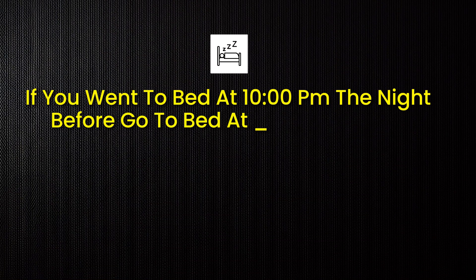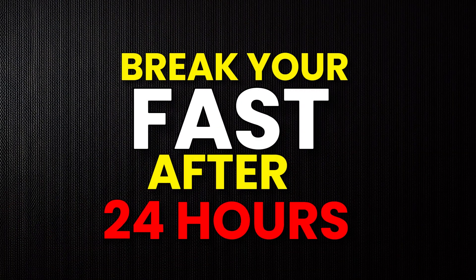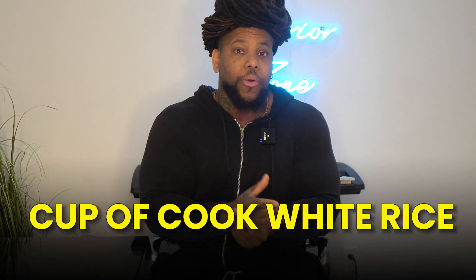I recommend doing two back-to-back 24-hour tests to really get an idea of where things stand. Keep your bedtime and everything else structured — if you went to bed at 10 p.m. the first night, do the same the next night. If you had a cup of cooked white rice to break your fast, do the same the next day. After two days, you'll have collected a lot of data and be able to make better shifts to where those basal segments need to change.